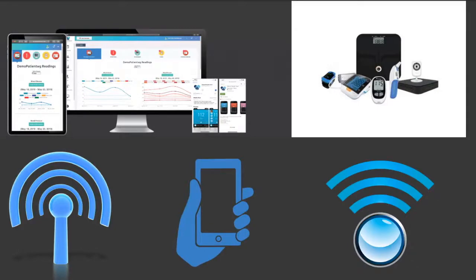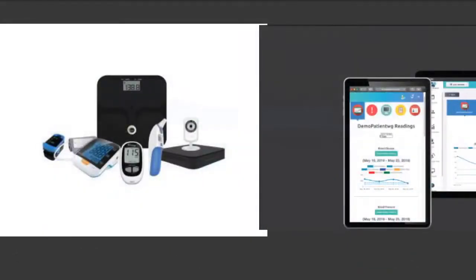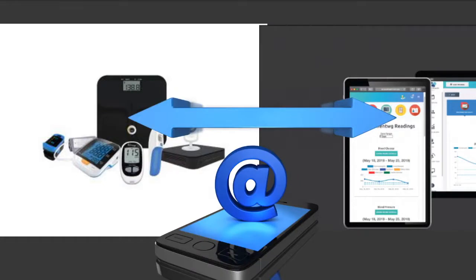Our platform and devices provide the ability to capture and measure diagnostic data remotely through Bluetooth, cellular, and wireless technology. The devices are provisioned to help pair on your first transmission, meaning they will sync to a user account right out of the box through the use of our mobile application downloadable at Apple App Store or Google Play Store and runs on smartphone, tablets, or TV.